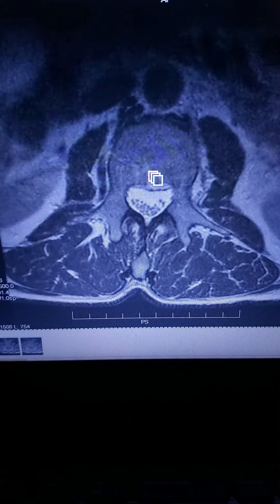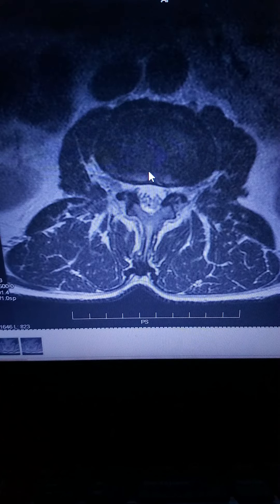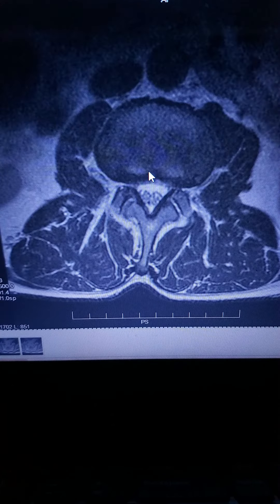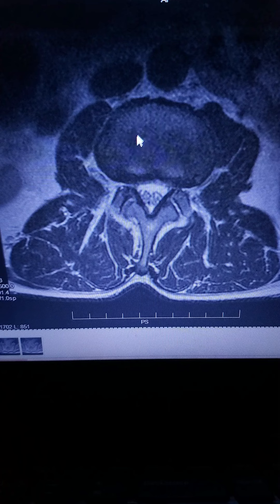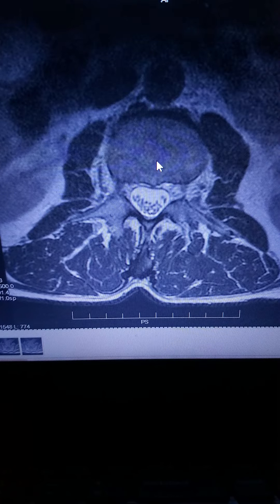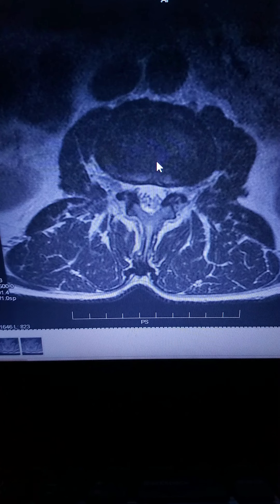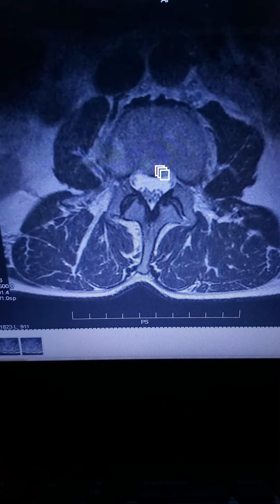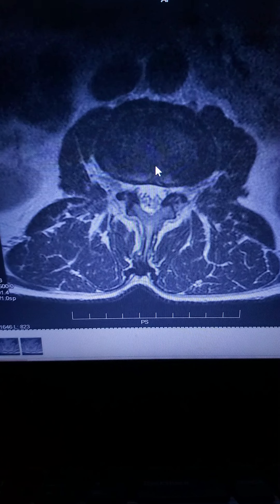Going down to L2-3, this is the disc — moving up, that's the vertebrae, that's the disc, that's the vertebrae. The disc is protruding, putting a little pressure on the spinal cord. There's a little bit of inflammation here of the ligaments.